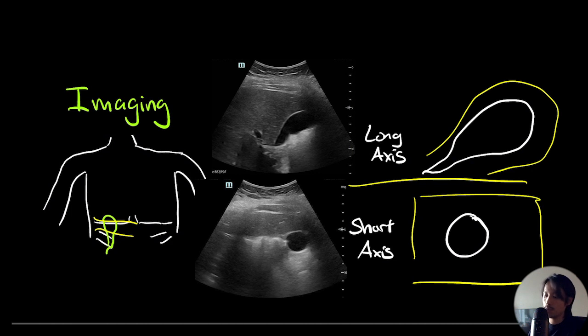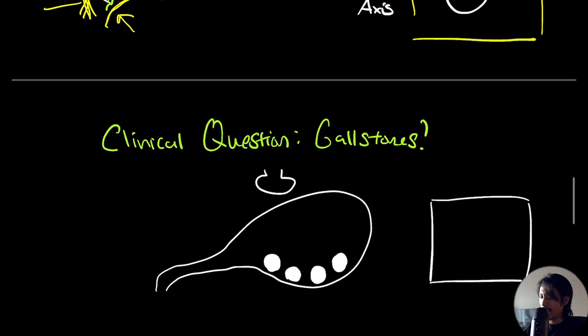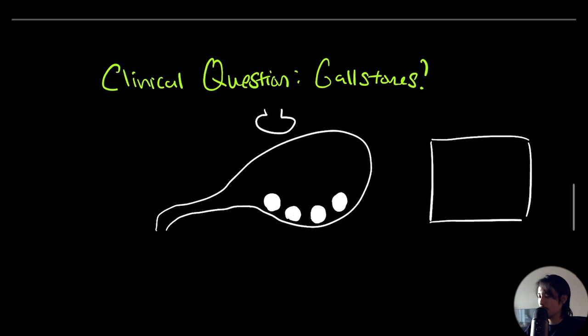There are two positions where we can image the gallbladder, and every patient, or in this case model, is going to have one that works probably a little bit better. You can either go sub-xiphoid, under the ribs this way from the belly down, or you can come intercostal from the ribs and view it that way. Okay, and we can try both with our models. And the most common clinical question when we look at gallbladders on ultrasound is, are there gallstones? Gallstones typically cause most of our gallbladder pathology, and so if you see them, it suggests something's bad going on.